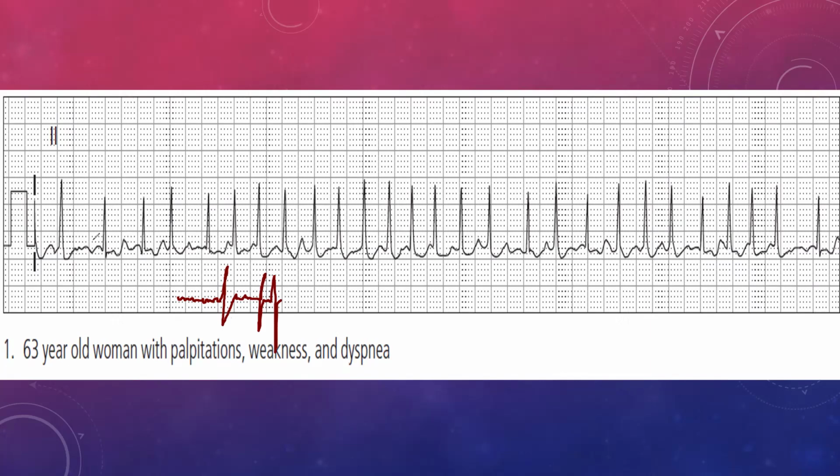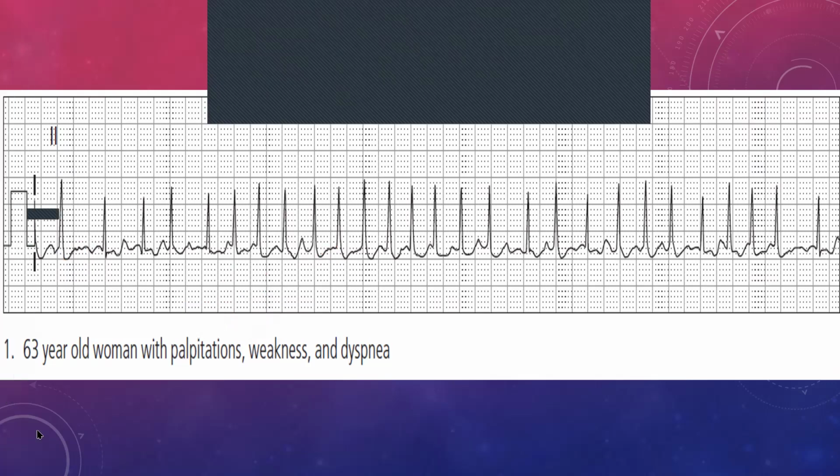But as you can see here, we've only got what would look like atrial fibrillation maybe in about one or two areas. And the reason for that happening is the fact that most of the P waves are hidden. So you don't actually see the fibrillation, because they are hidden behind the QRS and these T waves that have come up over here. Now, there's lots of reasons why a patient may present like this as compared to the normal presentation that we are used to seeing, but just keep in mind that it can happen.